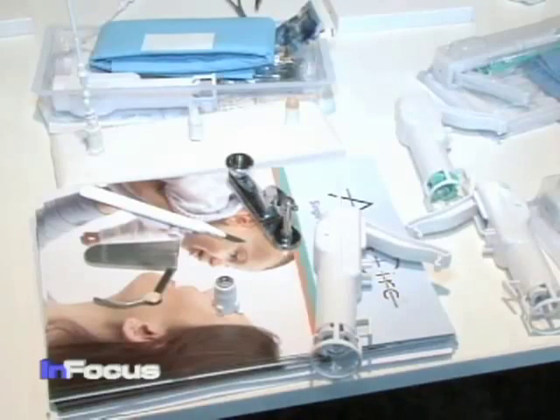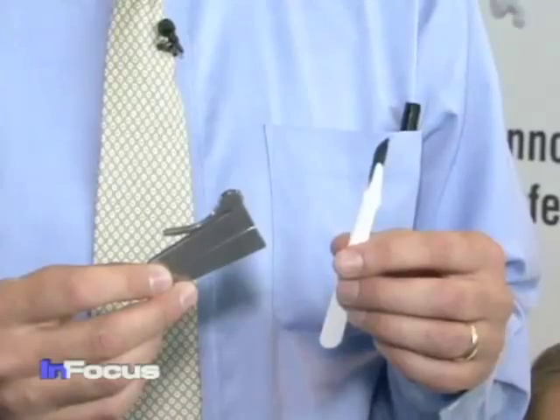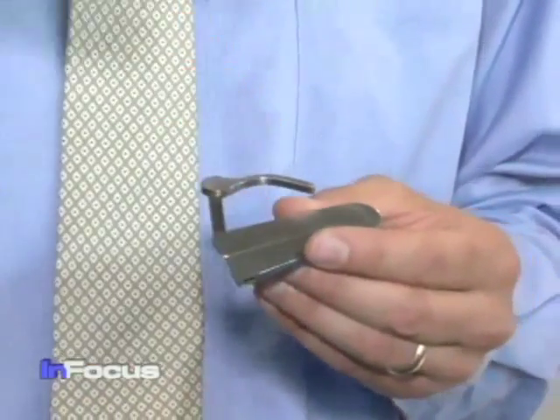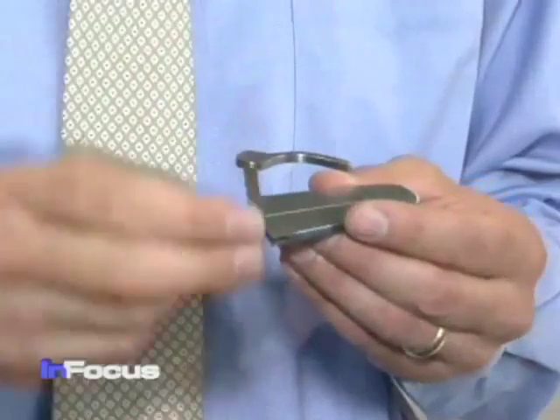Instruments currently used to circumcise males, such as these, can be reused and, if not properly sterilized, can transmit infection to other infants. Dr. Tomlinson says in the wrong or inexperienced hands, they can also be dangerous. If you get the tip of the penis stuck in the clamp and you make your incision, you can actually cut the top of the penis off completely.